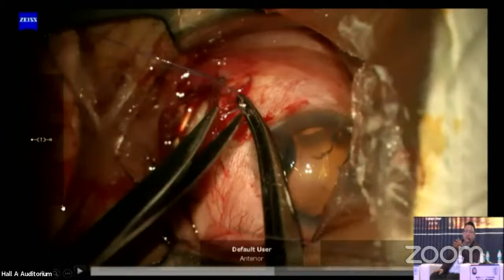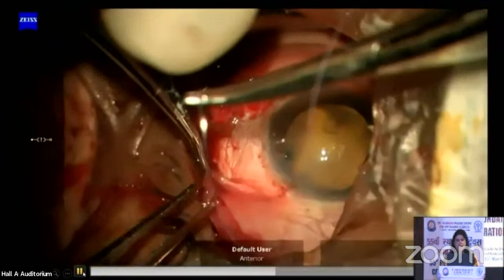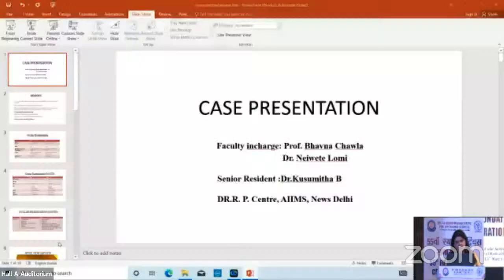One thing I would like to add here is that these are malignant conditions. So by doing these procedures, you are actually aiming for tumor control. And here it is the life of the patient that is at stake, not just the eye and the vision. So even if you have to sacrifice a muscle, or at some point you feel that there are some complications that are unavoidable, you may still have to go ahead, considering what your goals of this surgery are. So this is a little bit about the muscle. And then of course, the last step here, we are just closing the conjunctiva. So you can see how this is being done.